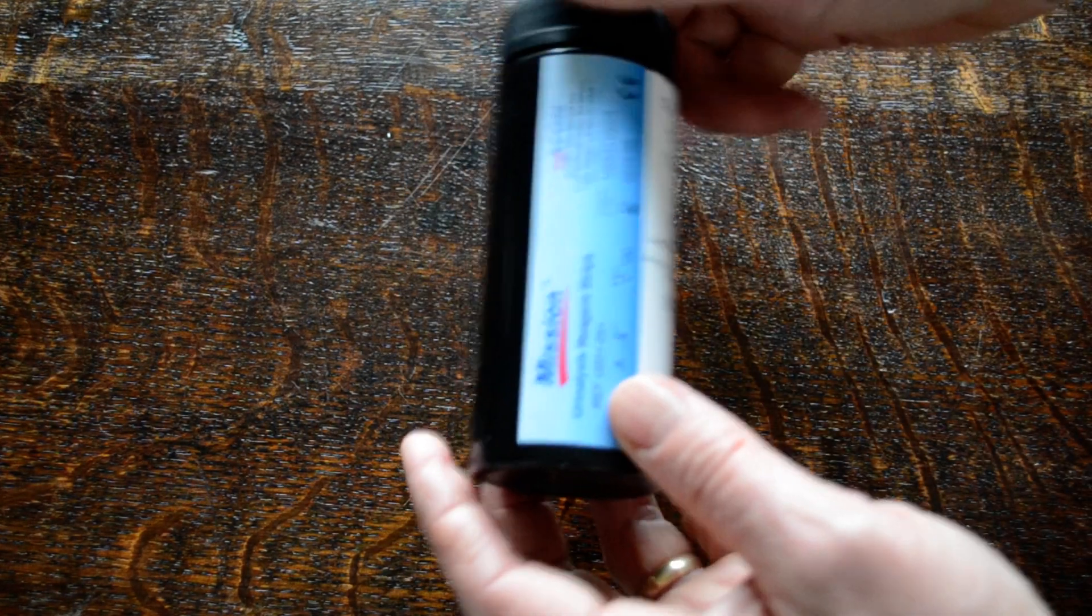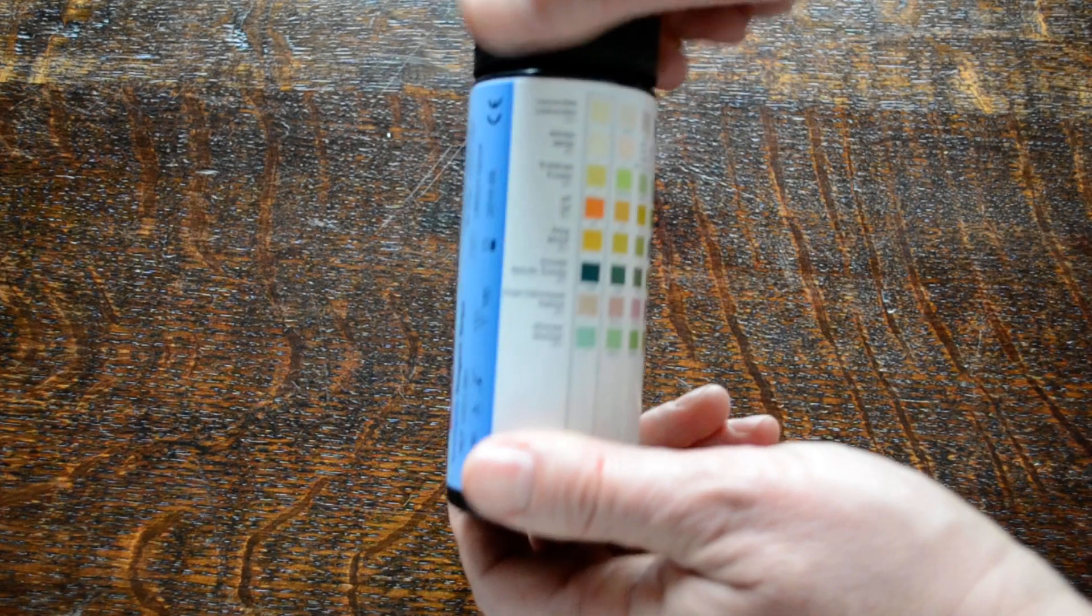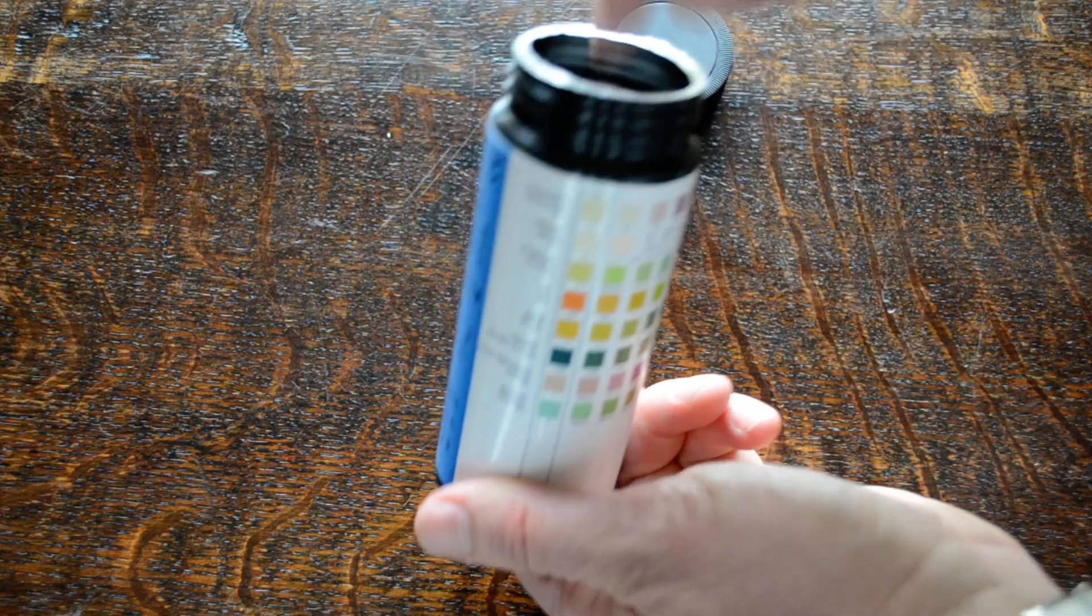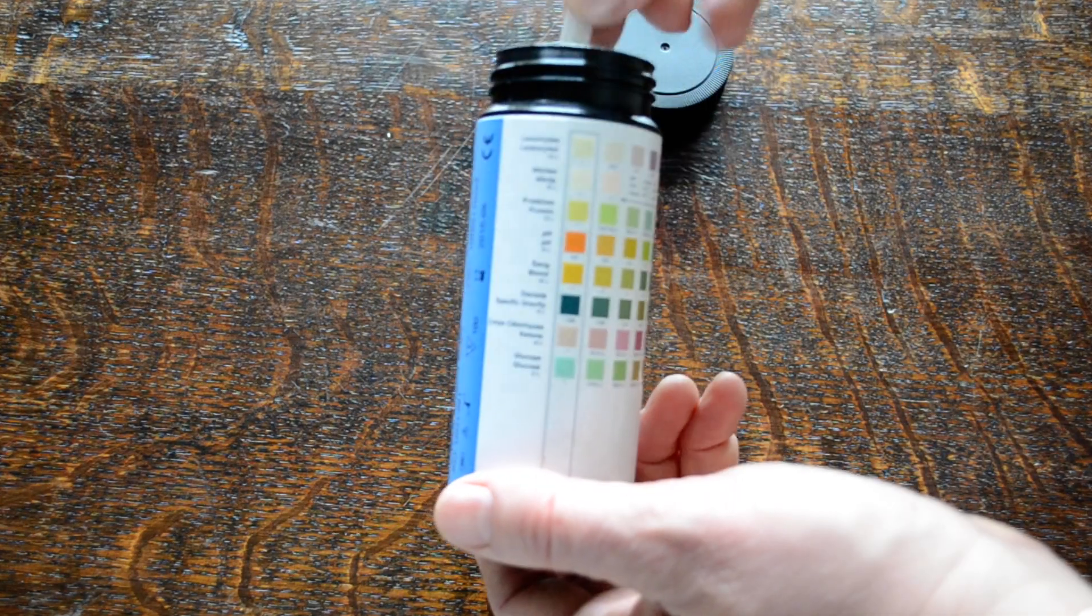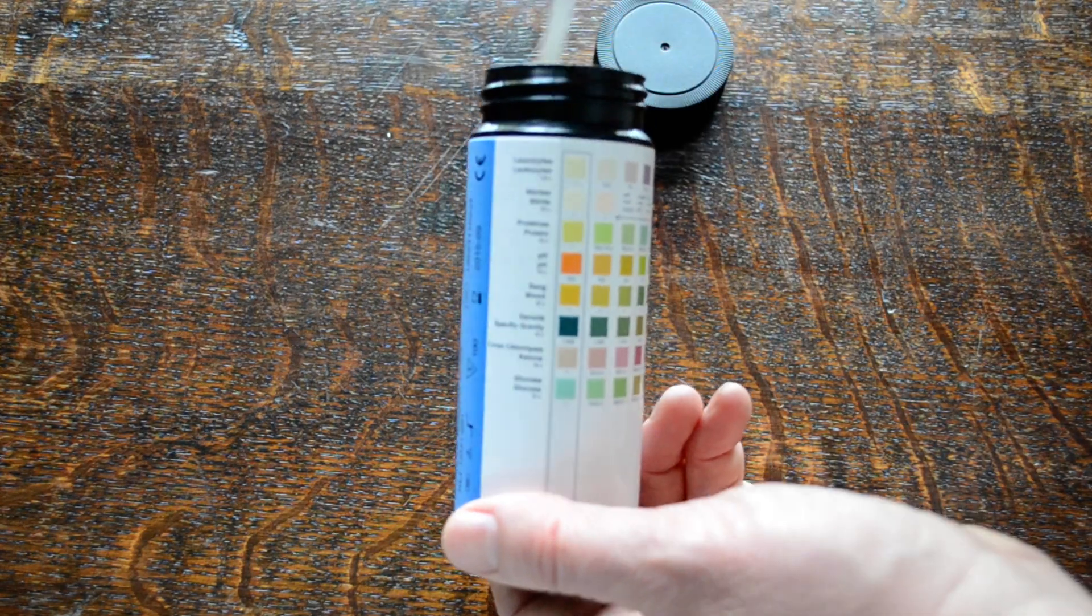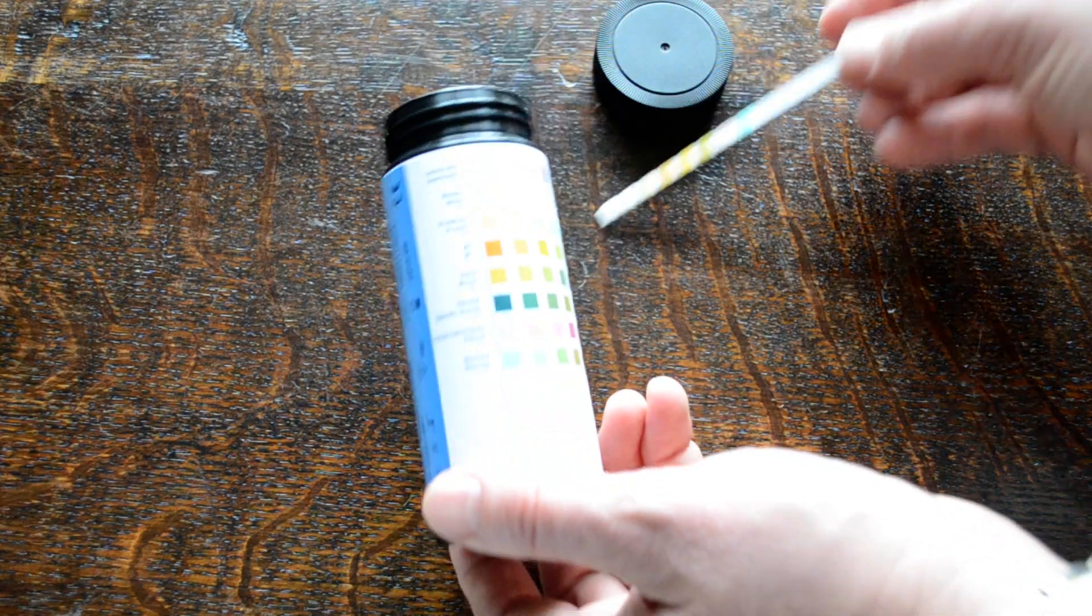Now this test strip is a very easy to do test. It basically only takes a couple of minutes to perform one of these tests.